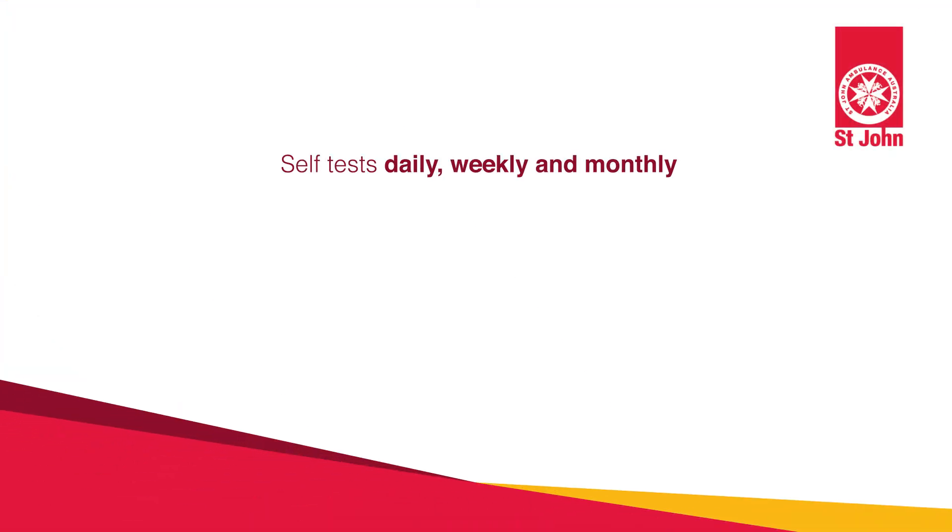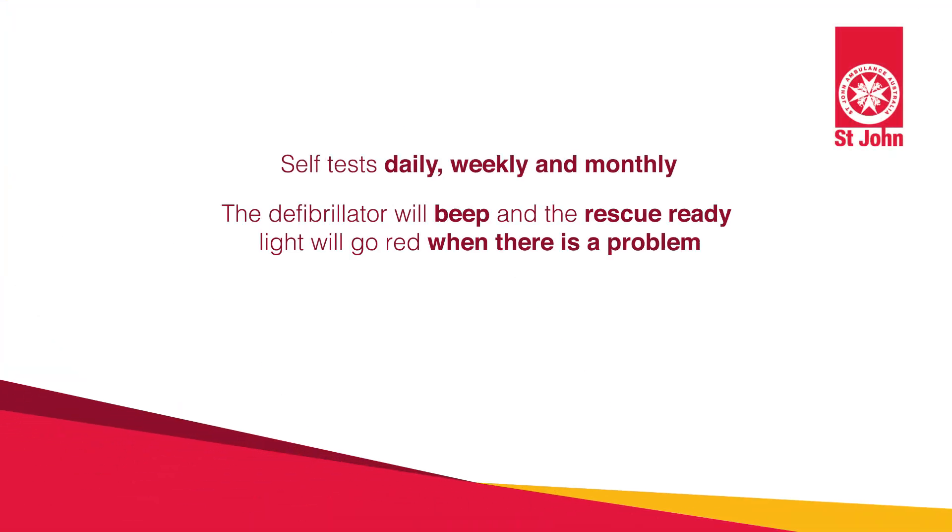Defibrillators self-test on a daily basis. A G5 defibrillator will let you know there's a problem when it makes a beeping sound and the rescue ready indicator is red. When this happens, check the expiration date on the pad packaging to see if it's expired.